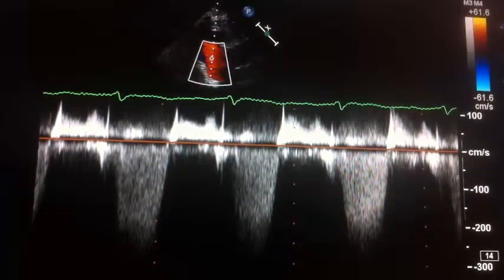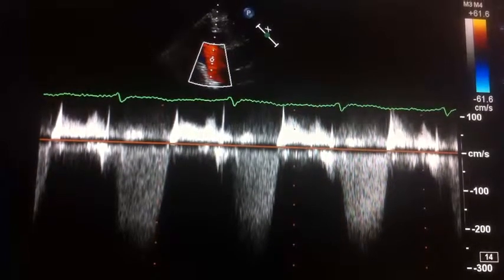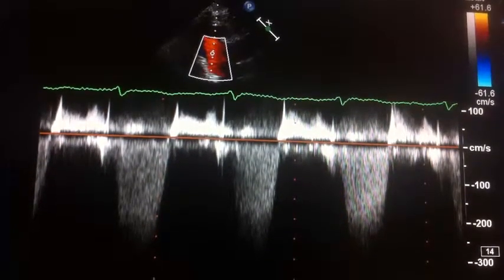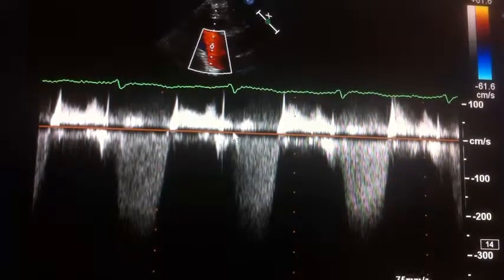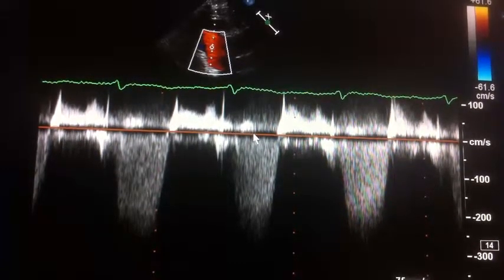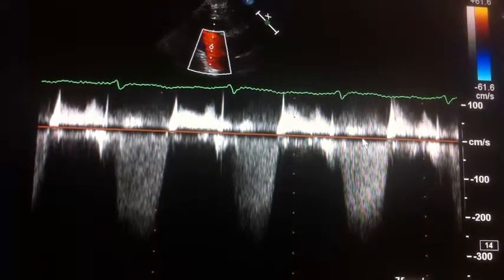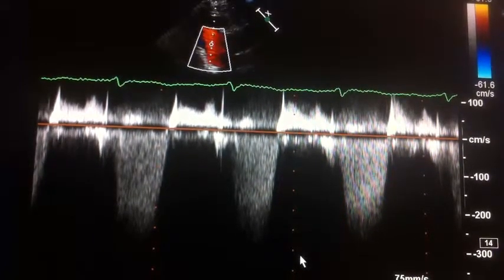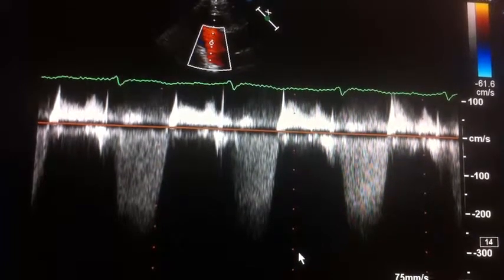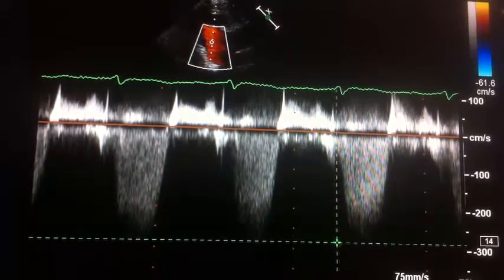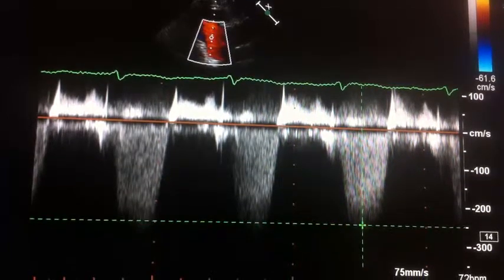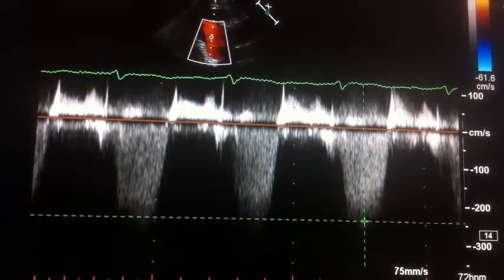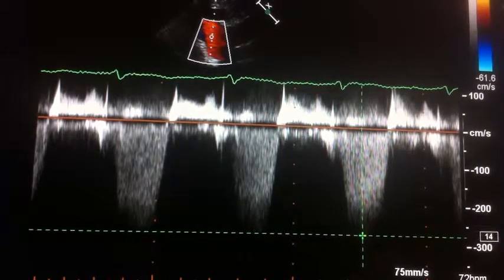This image is a Doppler image, which tells us velocities of blood flow and tissues in the body. This line right here represents zero velocity; going this way is time, and going down is velocity — so this is velocity over time. A typical measurement we'll do with the calipers is a single-point peak velocity measurement, which also gives us a peak gradient. We can derive gradients from these velocities.